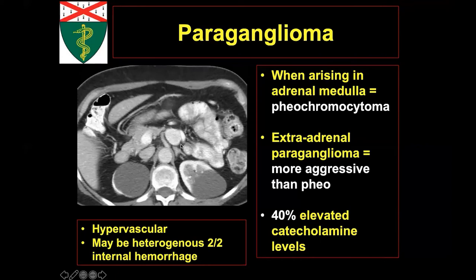And so these sometimes have been described, at least in the adrenal gland, as having a light bulb signal. And I don't know how accurate that always is, but one thing that we do see somewhat consistently is their hypervascularity.